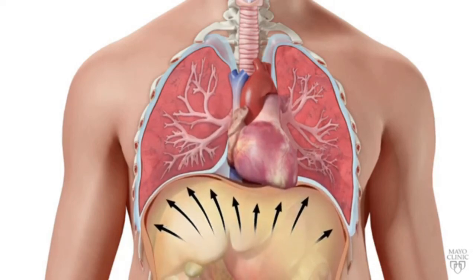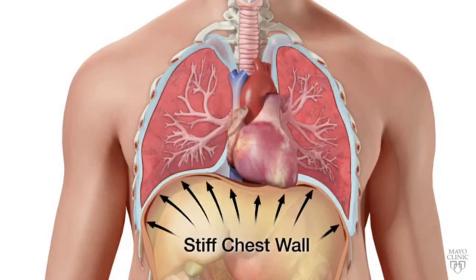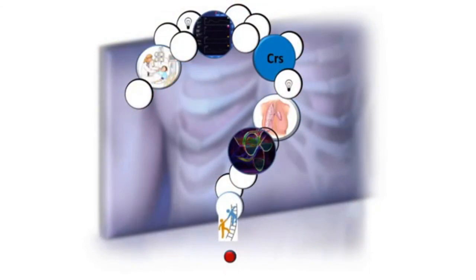This makes plateau pressure an unreliable measure of safe lung ventilation. So if tidal volume and plateau pressure may not always be accurate in setting up safe ventilation of the baby lung, what do we use? And that's why we want to explain to you the concept of driving pressures.